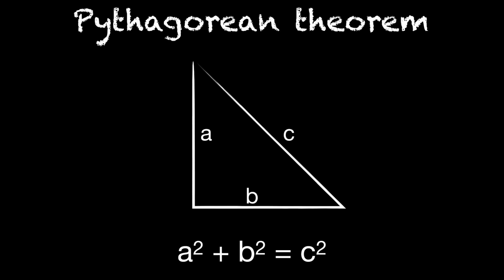Now we can, before we even start, consider how far we're going to need to go in, and this is part of the advantage of using the 45 degrees, because we can think of the Pythagorean theorem, and essentially, whatever our depth is will be the same amount of length that we're going to travel if we go at 45 degrees, and then we can know close to what amount of catheter we're going to need to get that far.